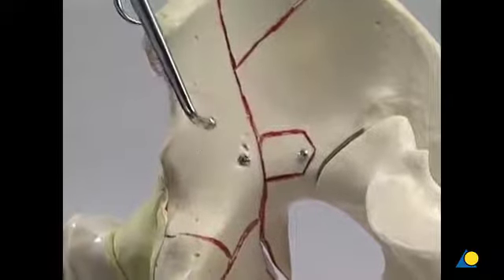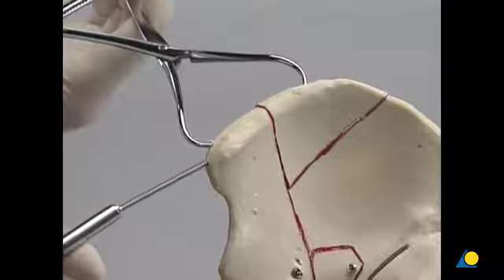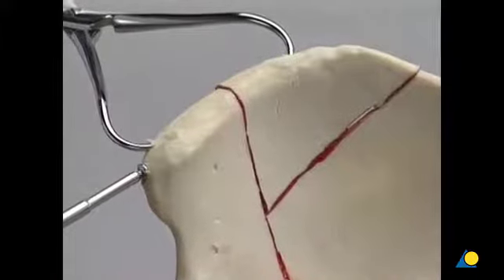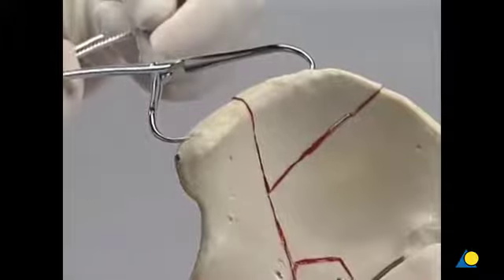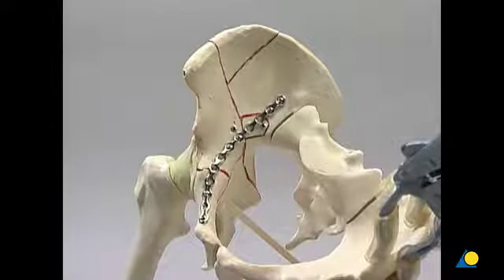The pelvic reduction forceps is removed. A lag screw is now inserted across the iliac crest. The reduction forceps is removed. A 12-hole 3.5 J-shaped reconstruction plate is contoured to fit the pelvic brim. The plate must be long enough to provide adequate fixation of both the posterior and the anterior fractures. This plate usually is extended to the pubic body.